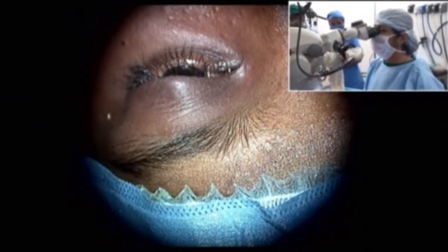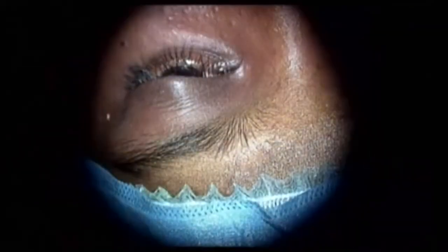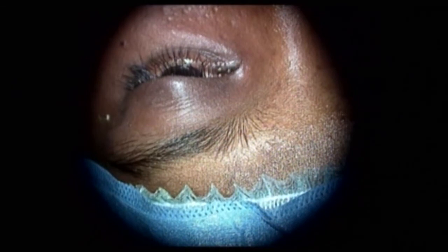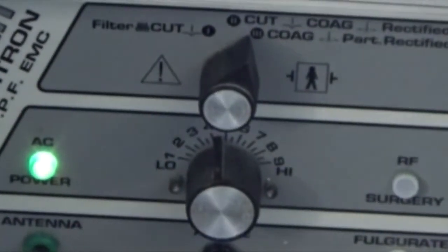Any particular setting on your RF? One important thing I'd like to warn people who are using the RF: the smoke has to be sucked, otherwise it's carcinogenic. So we make sure that we protect ourselves first before anything.